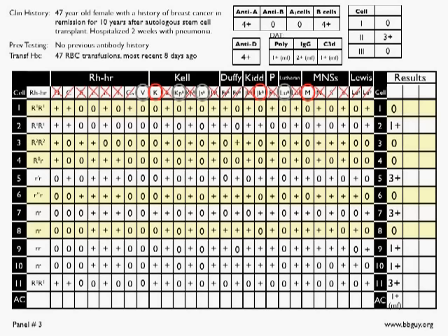So let's look at those three antibodies, and let's see if any one of them makes sense for all of these positive reactions. Again, let's look at what's there now. Let's look at the positives. All right, let's look first at what we see over on the right in terms of how the reactions look. Again, we have three pluses, we have one pluses, and we have negatives. How does that match up? Well, first, let's look at anti-big K. Certainly, we can say right from the beginning, by itself, anti-big K does not answer all of these questions. It doesn't answer all of the positive cells. So I actually like to start there with that caveat to see if I have one antibody that can explain all of them and go from there.